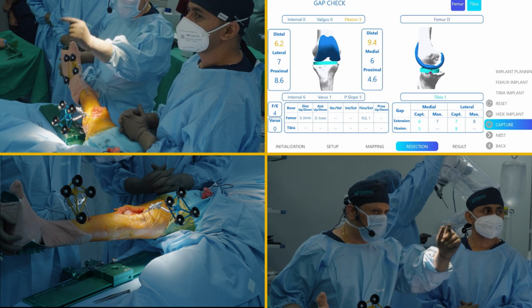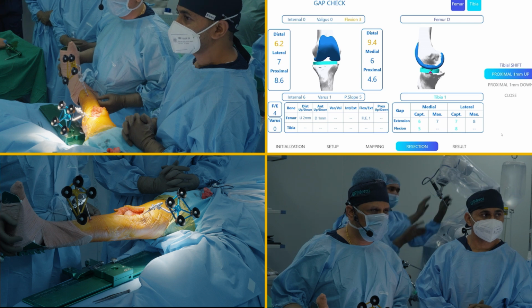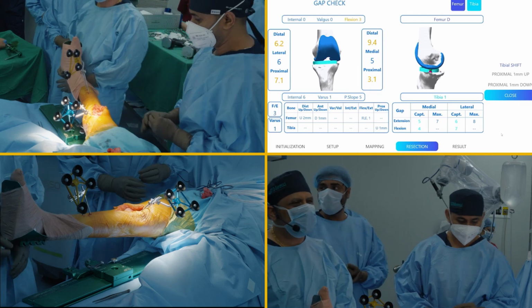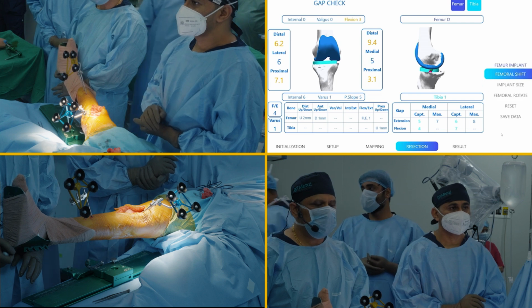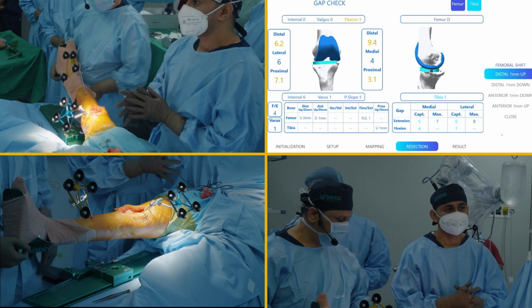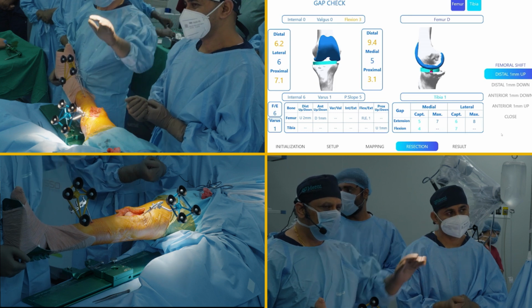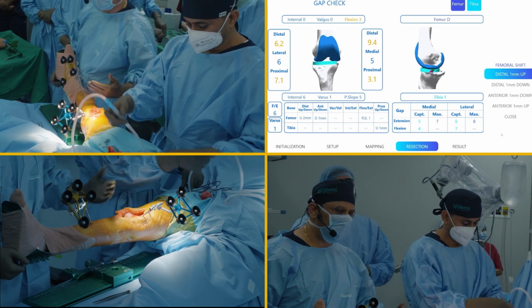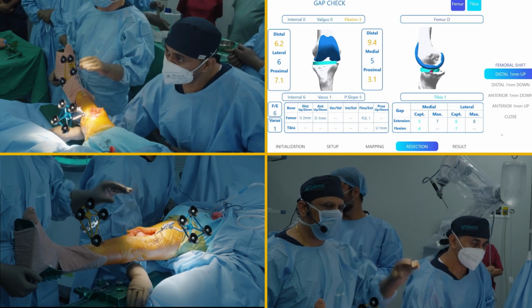So now the tibia, I'm shifting the tibia up by 1 mm. Yeah, that's enough. Now this is my plan. If you can see what all I did, close. So now the femur implant. If you see the femoral shift, these are the options you have on the femur. You can proximalize the component, distalize the component, and shift the component posteriorly and anteriorly. So these are the 4 movements you have on shift, where you can go up or down, distal 1 or 2 mm, whatever it is, and shift the component anteriorly and posteriorly.